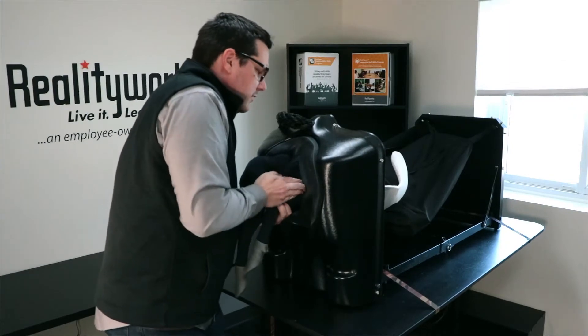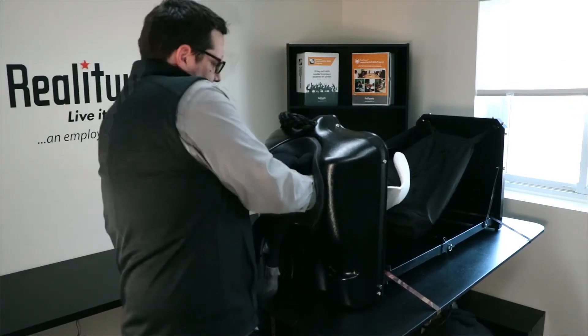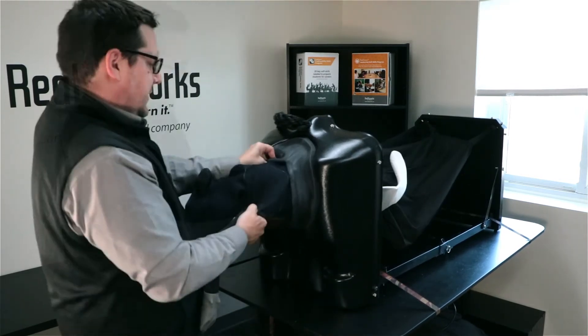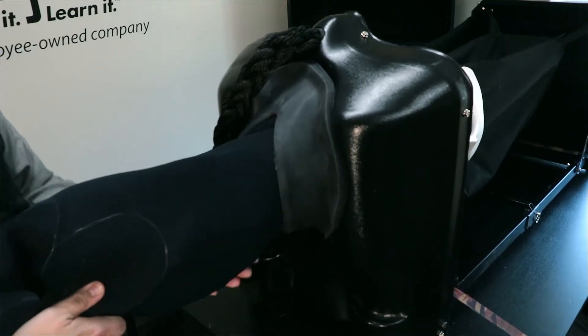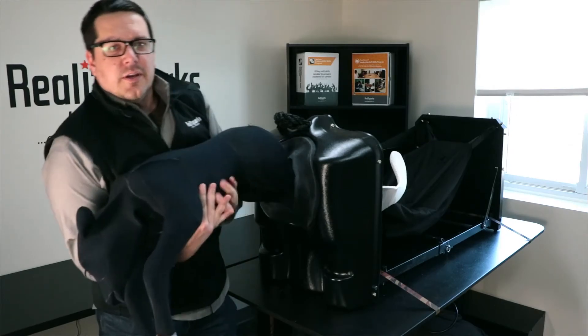It's now kind of stuck in the shoulder blades, so moving that and allowing it to come out — but then it's stuck in the hip area. Working through here again, I can go in, help it through, and then pull our calf out completely.